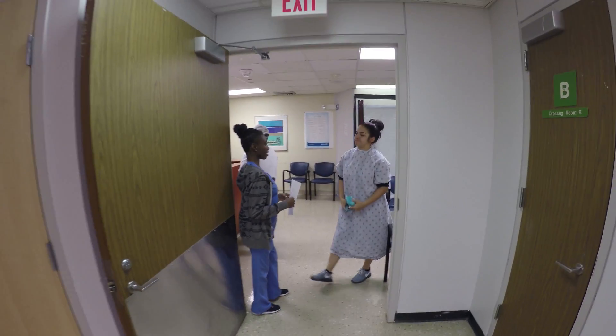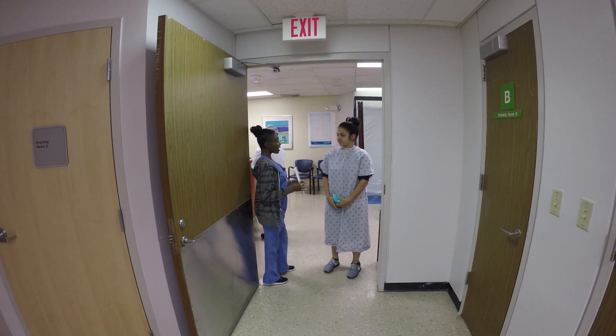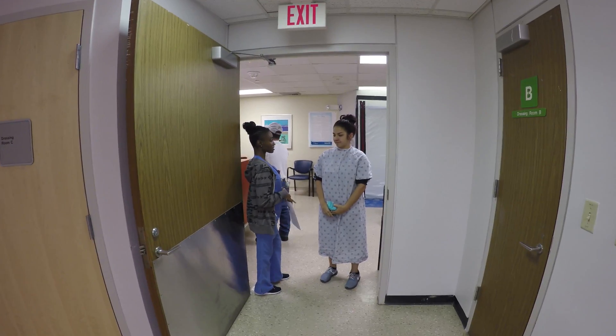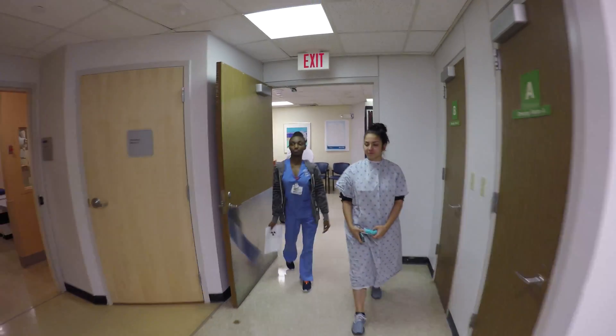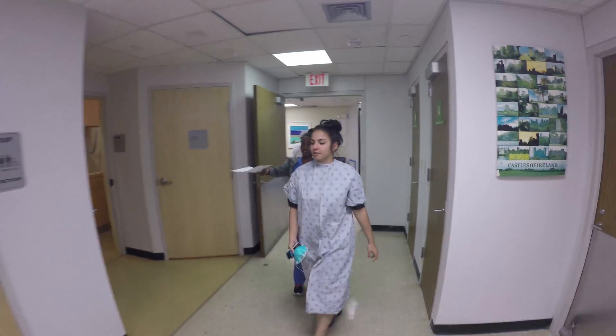Hi, I'm Marielle. I'll be your technician today. Can you verify your date of birth? Perfect. And we're going to go right into the x-ray room.